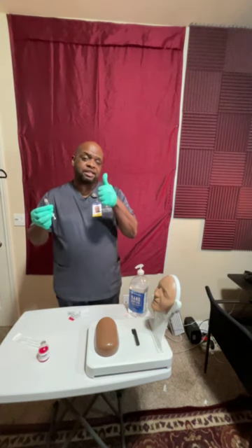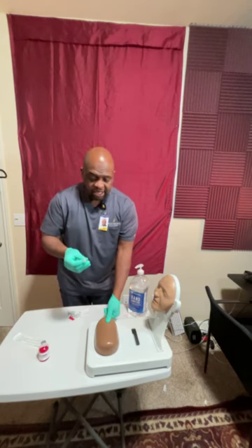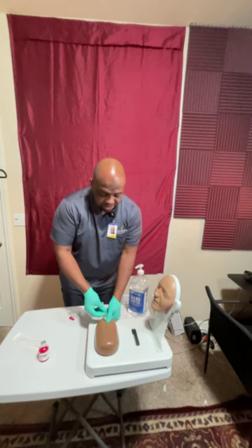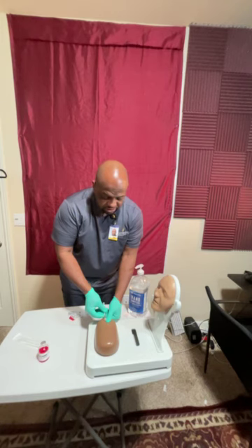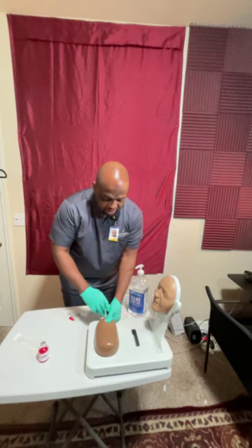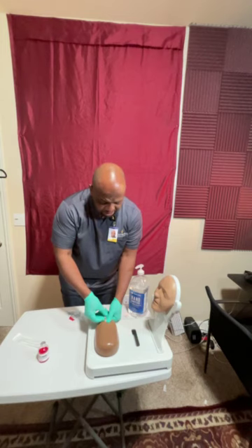With my non-dominant hand, I'm going to use my thumb. I'm going to pull the skin tightly, right? I'm going to pull it tightly. And at a 5 to 15 degree angle, I'm going to come in close to the skin, and then insert the needle into the skin at a 5 to 15 degree angle. Right up under the skin, once I see that bulge of the needle, I'm going to slowly inject the medication into the skin. Mr. Jones, like I said, it will feel like a little insect bite, but hang in there, you're doing good. And I'm going to remove the needle, right?